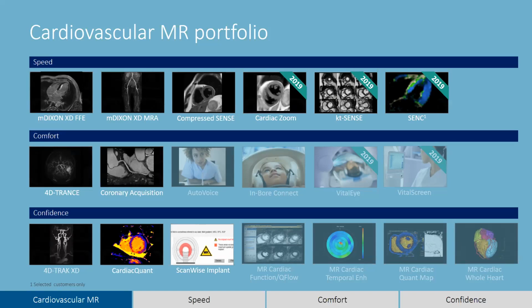Just for some measurements, for example, when we do the hemochromatosis study for the liver, we take some ROIs inside the liver and some ROIs inside the muscle, and we need, for example, the background, the measurement without signal.